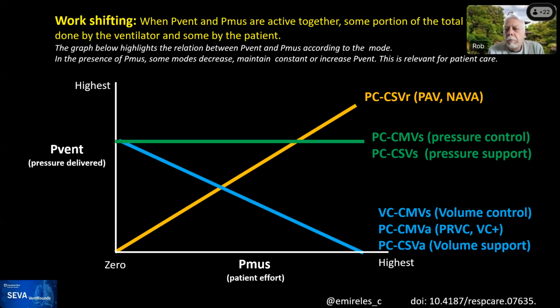And finally, the targeting scheme, which is adaptive. Adaptive means that you set a target tidal volume. That's where the confusion usually comes: you set a target tidal volume, but that is a target, and target doesn't mean that you control. Target means that the machine is going to try to achieve the target tidal volume that you have set. And so that's what PC-CMV-A stands for.